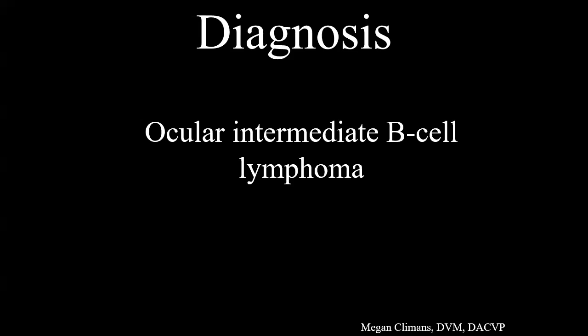And essentially staging the patient is all you can really do to determine whether or not this is multicentric lymphoma that is also involving the eye or potentially a primary lymphoma confined to the eye. In this case, either way, there's concern that this patient may still have tumor cells in the body. So, all right, that is it. I will shift.